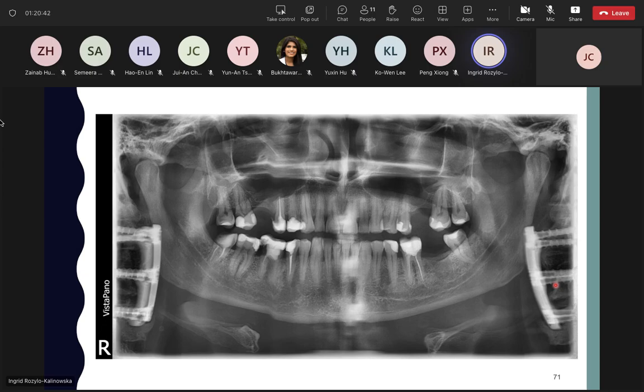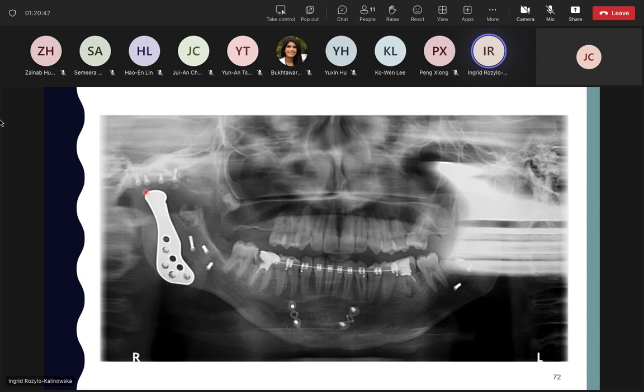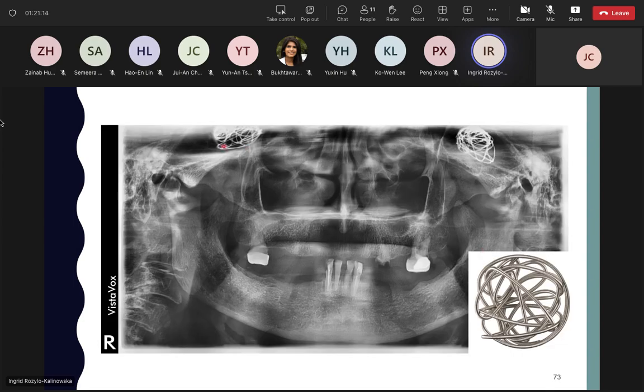and maybe also some surgeries. And as mentioned before, also TMJ prosthesis with very, very strong, big a ghost shadow of a prosthesis. So once again, I would like to highlight that, of course, it's not possible to remove the whole prosthesis. And this is interesting. You haven't seen this thing in the seminar.